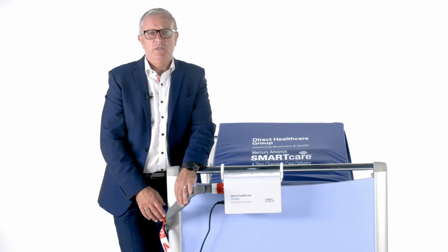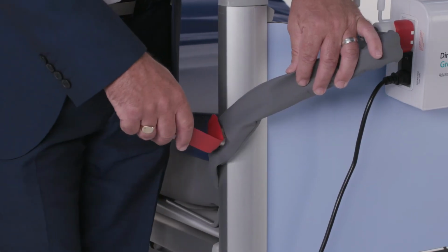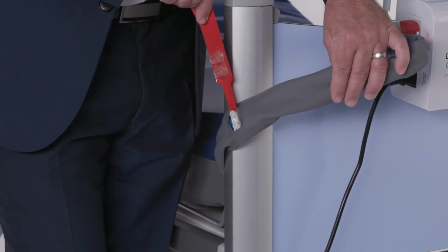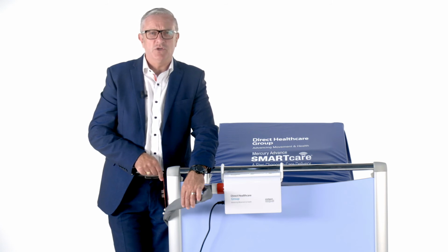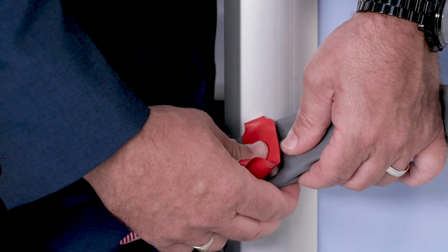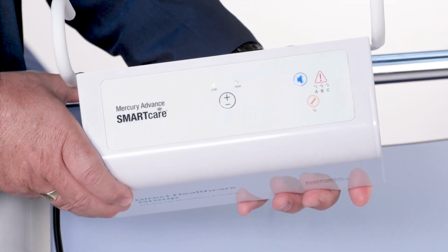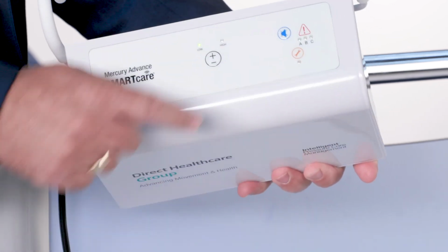When the mattress is being used in the powered mode and CPR is to be given, the CPR release tag located on the umbilical tube set should be pulled. This will allow the mattress to rapidly deflate, providing the medical emergency team with a firm, stable surface below the patient. Once the emergency is over, the tag should be replaced to ensure that the mattress can be used in its powered mode. Should the pump experience a fault, the user will be indicated via an audible visual warning system.